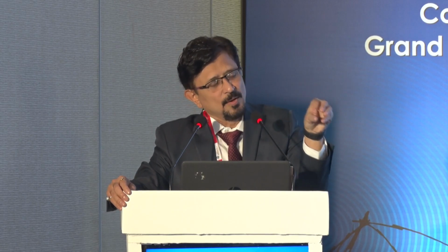Now, the question here is that earlier we used to have multifocal lenses wherein the central optical cylinder was smaller. It was 0.8. Now, in a couple of lenses, the central optical cylinder has increased. It has gone to 1.2, 1.4, and that is why we have got that extra leverage. Even if somebody has an angle alpha of 0.5, if the central optical cylinder is 1.2, then you can implant a multifocal implant. So that is what we have to understand.